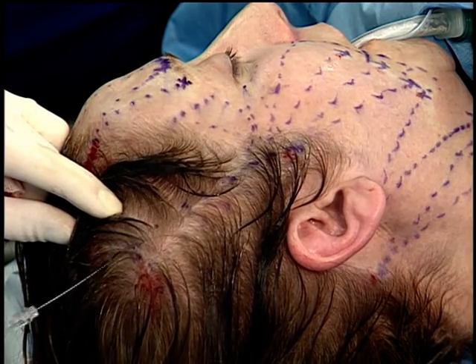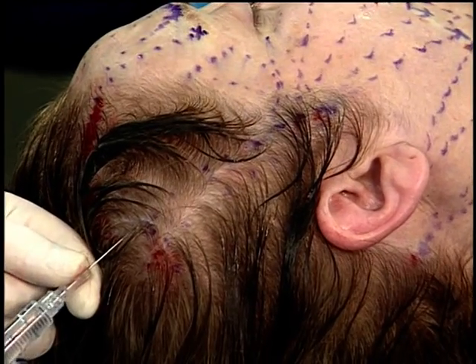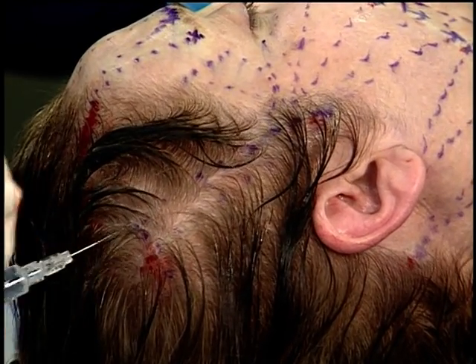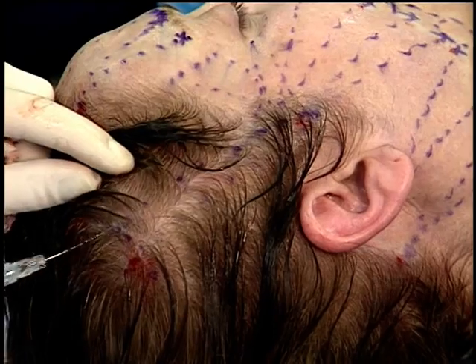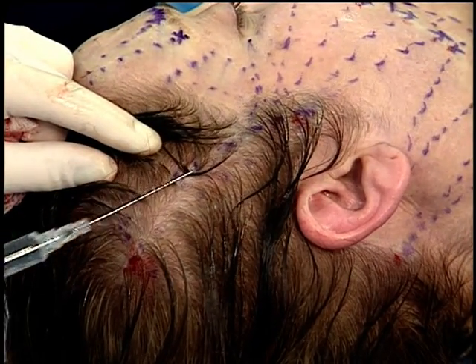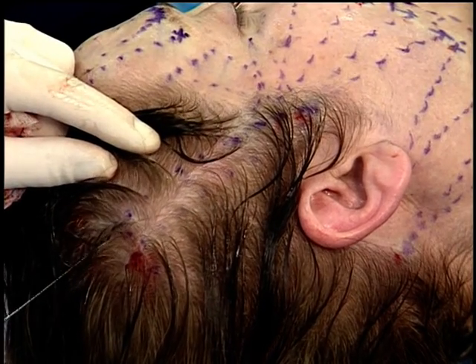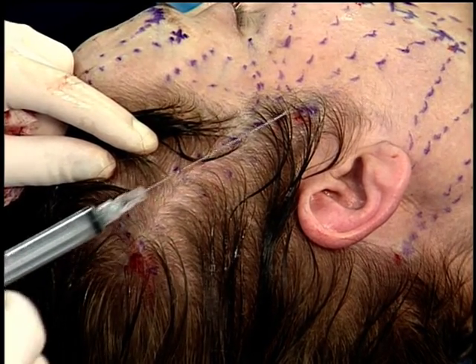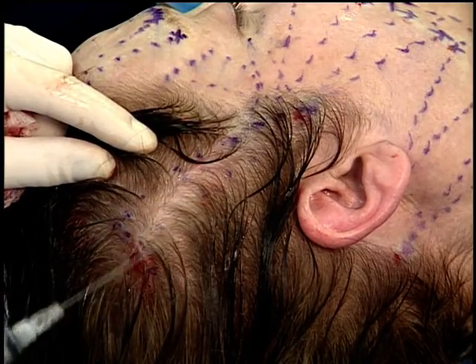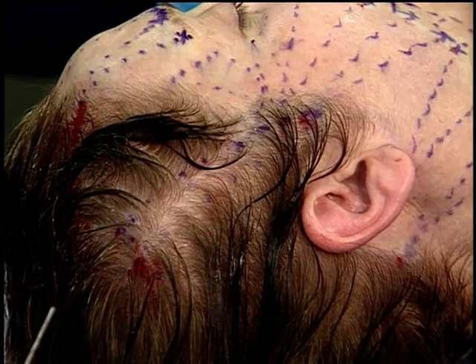So we've got a nice hydrodissection. Again, we're going to dissect on the way down in that nice areolar plane, in the temporal parietal fascia, dissect our way down that temporal scalp, come out, go in halfway, and down to the exit point. And then withdraw and inject. Withdraw and inject. That nice loose temporoparietal fascia. So we've got both limbs of our U loop lift for our articulus thread.